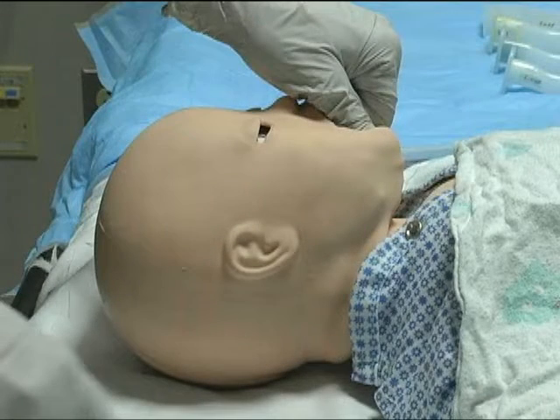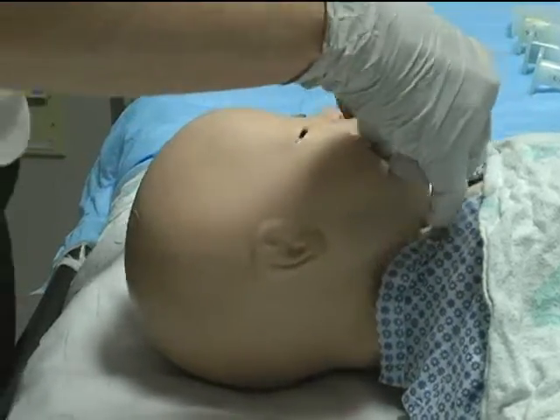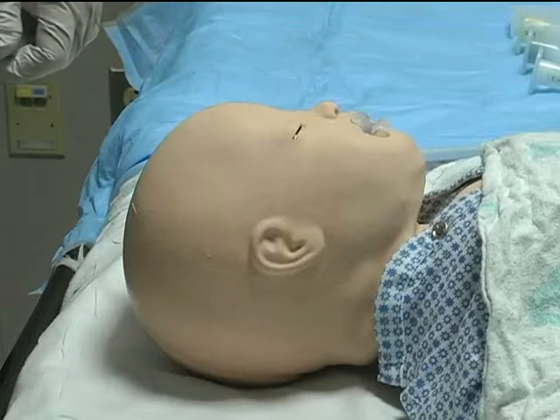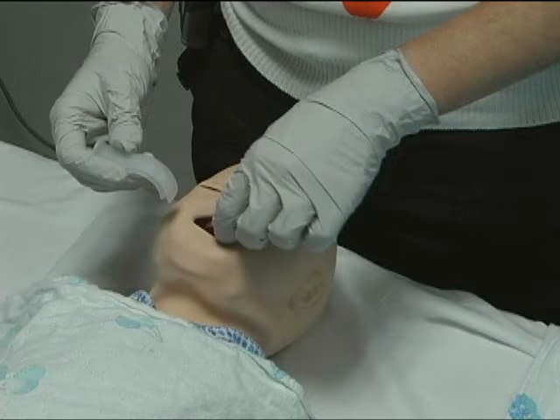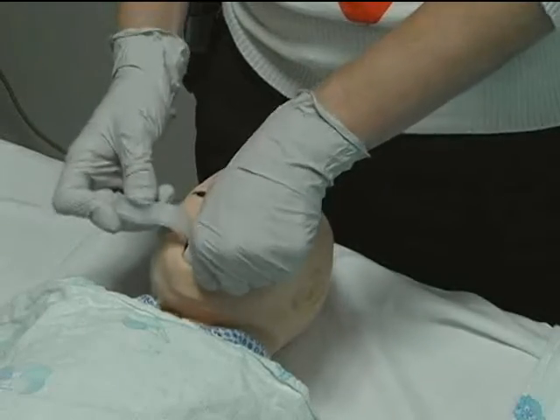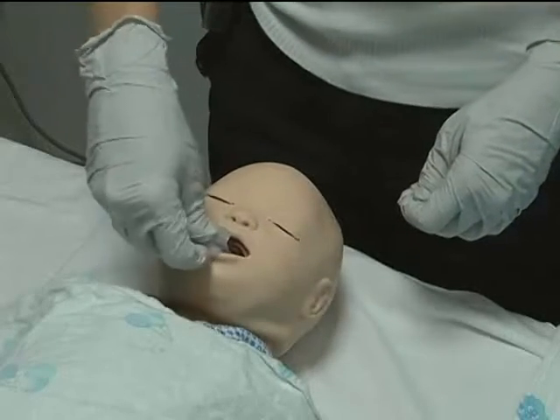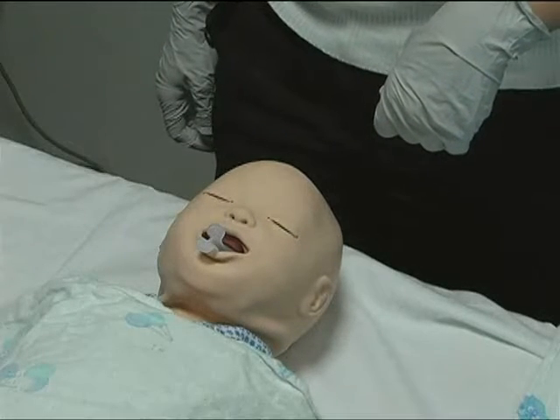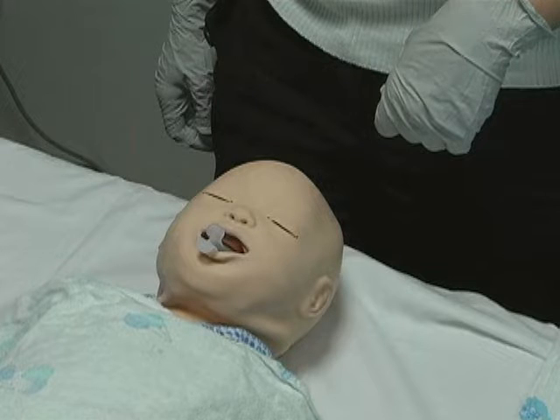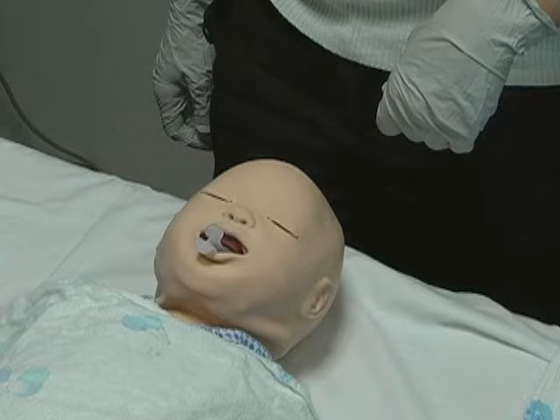The OPA may be placed either straight with the curve position down or at a right angle to this position. For placement using the curve down position, gently slide the OPA down the tongue until it sits comfortably in the oropharynx with the flange resting at the lips. For placement using the OPA in the right angle position, insert the OPA in the mouth and then gently turn the OPA so that the curve is facing downward and it rides along the tongue until in position with the flange at the lips. Confirm airway patency by assessing for chest rise, breath sounds, and oxygen saturation.